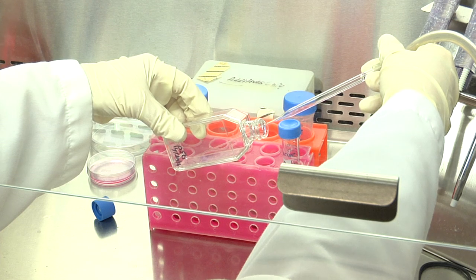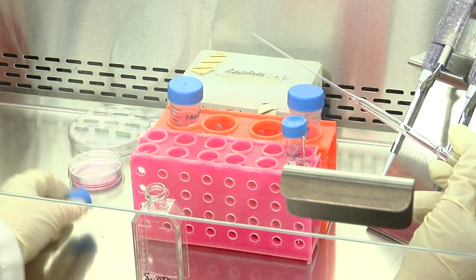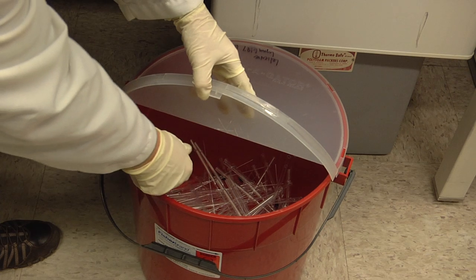Carefully remove the pipette from inside the flask and place the cap of the flask immediately on the flask. Remove the pipette used to aspirate the medium and place it in the appropriate discarding container. Close the lid.